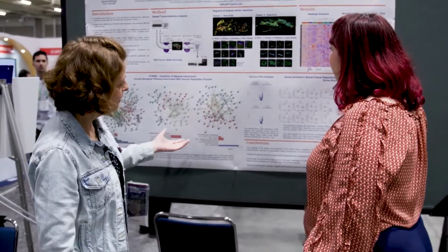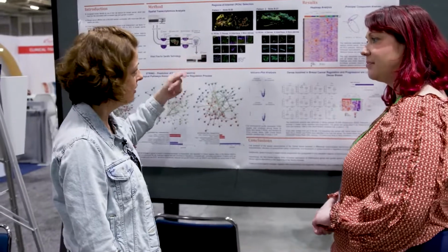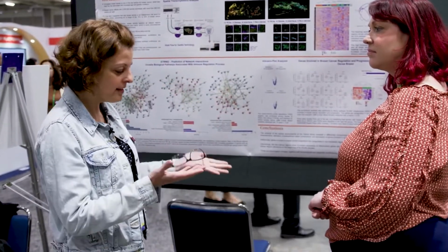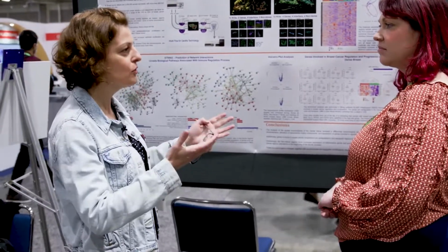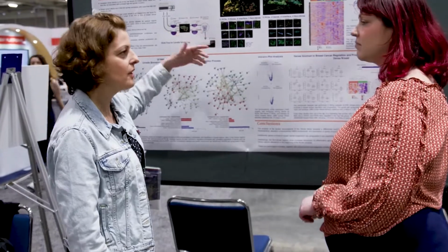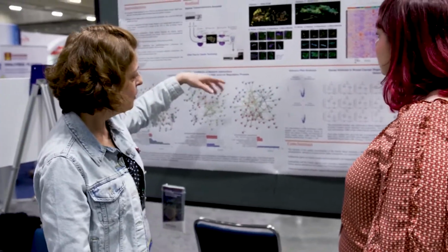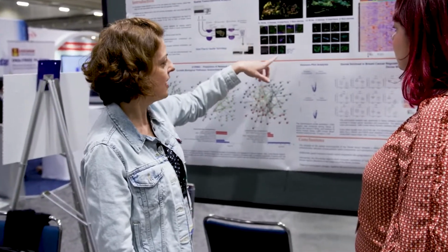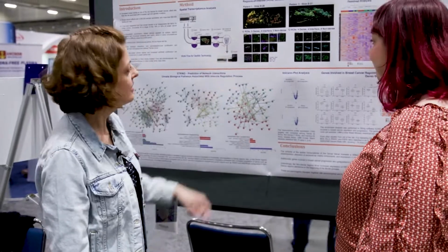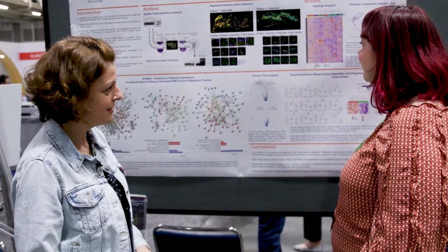And this is a very nice platform because first you can stain your tissue, using 4 morphological markers to understand what kind of tissue you have and what you want to select. For example, if I want to select immune cells, I use a specific marker for that. And here you use vimentin and SMA and cytokeratin. Yes. And then you can select these different regions to analyze and compare.